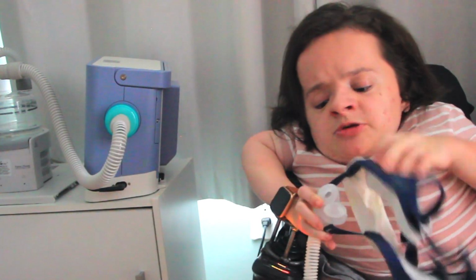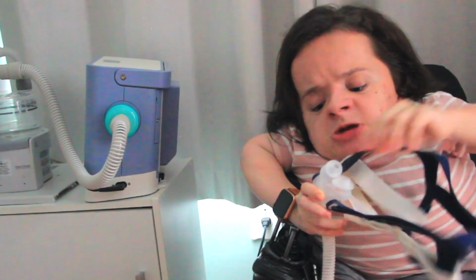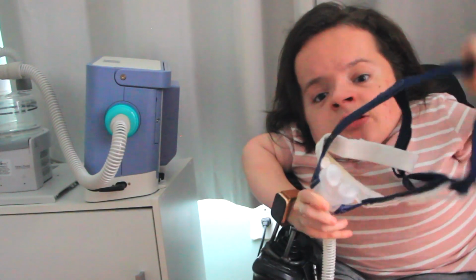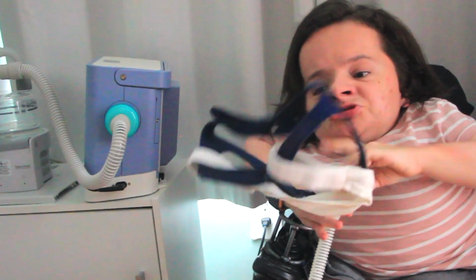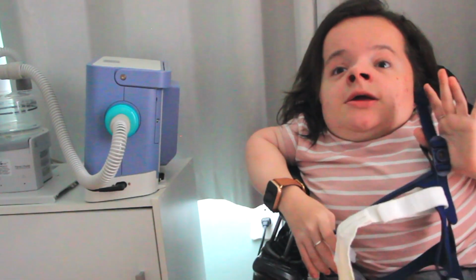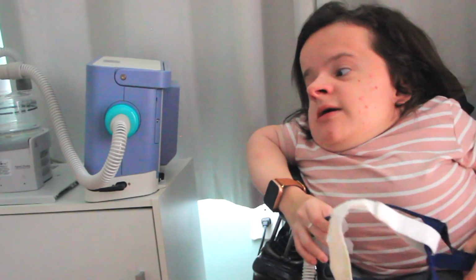This is the chinstrap, which I'll get into once I get into the equipment part of it. This is the chinstrap, and this is what's called the headgear, and this is the nasal pillow. And this green thing, I'll get into all of this machinery and I'll try this on and show you guys what it's like, and all that tubing and stuff. That has to all be replaced once in a great while, and that costs money.